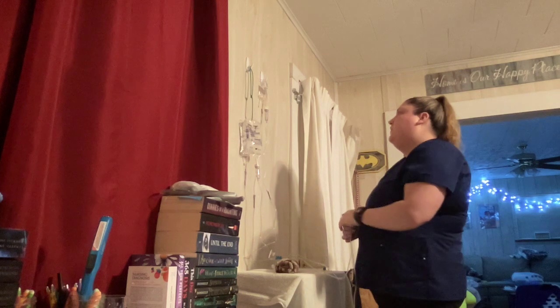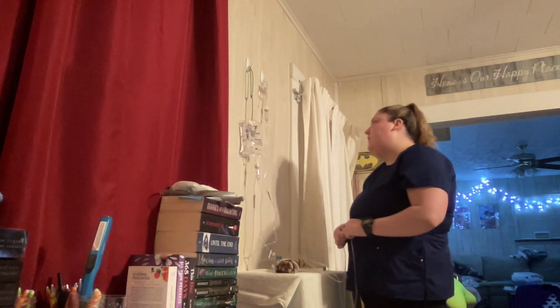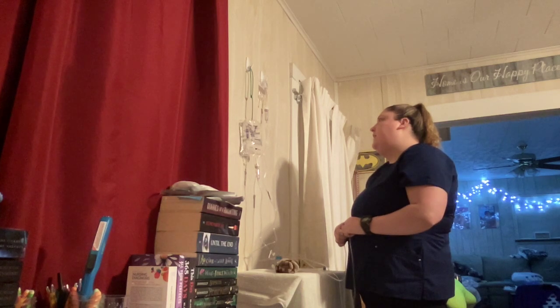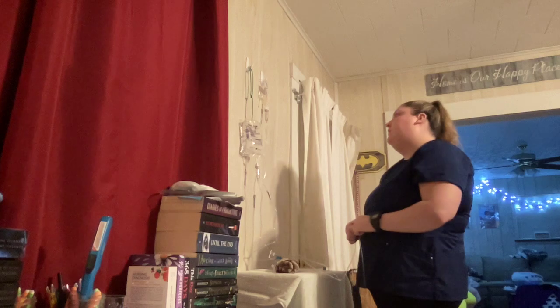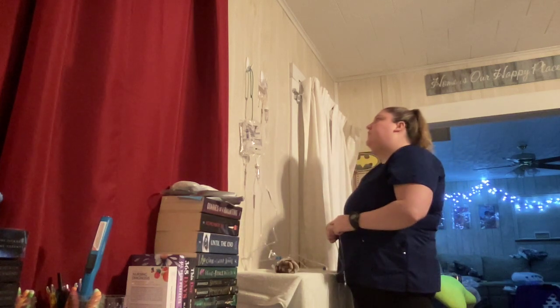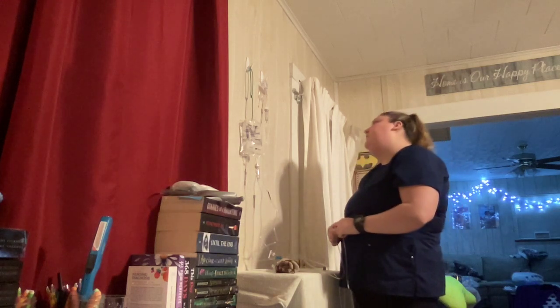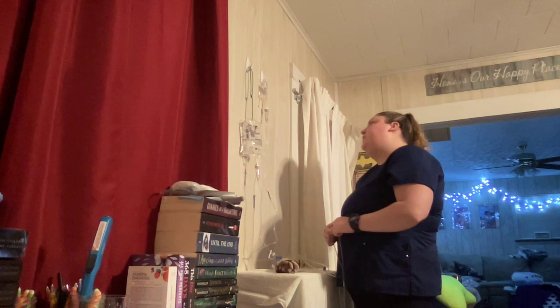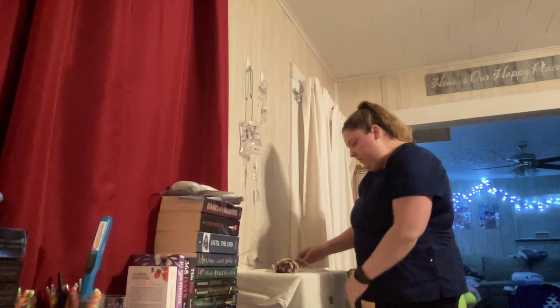Start again. 1, 2, 3, 4, 5, 6, 7, 8, 9, 10, 11, 12, 13, 14, 15, 16, 17, 18, 19, 20, 21, 22, 23, 24, 25, and that is a minute. So we are at 25 drops per minute.